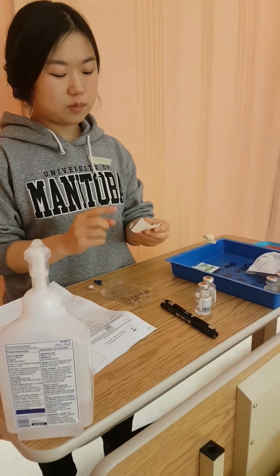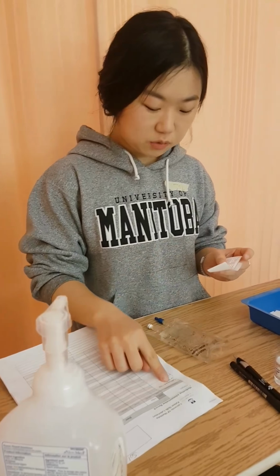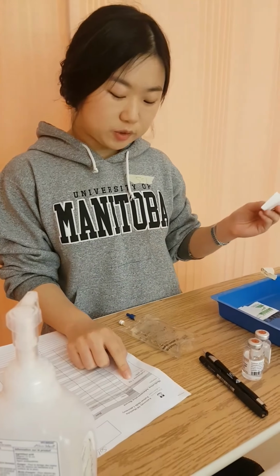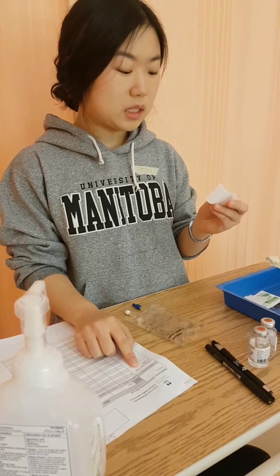So I've labeled the patient's name, John Smith. And the drug name is Ceftriaxone. The dose is 1.5 grams. The volume that I pulled up was 15 milliliters, and the diluent is 50 milliliters of normal saline.